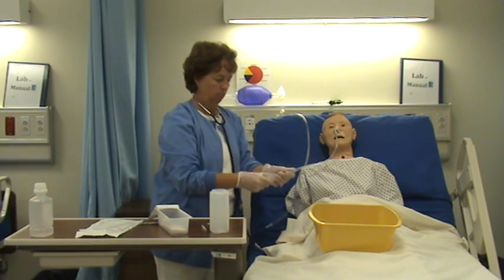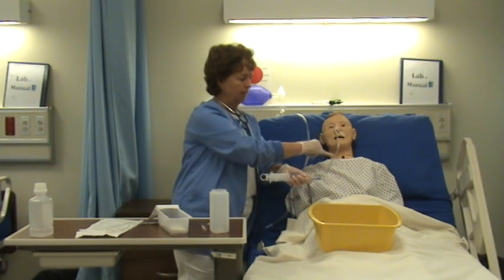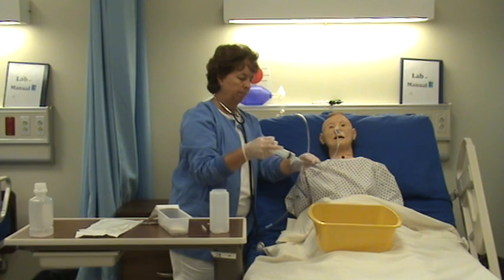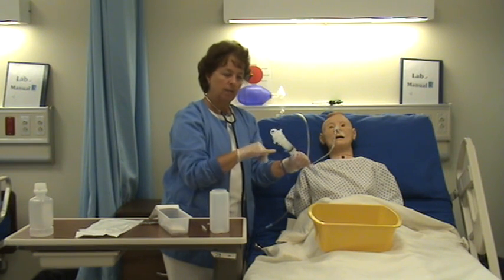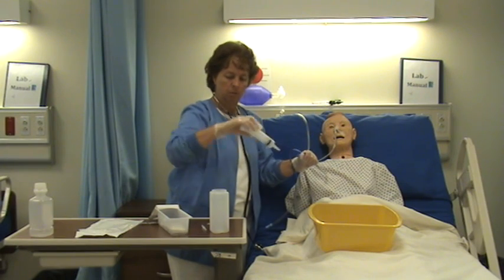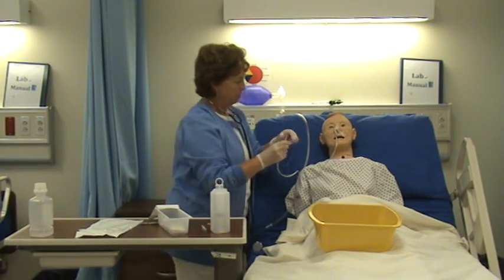The other method, which we're required to do in addition to auscultation, is to aspirate back. I can see some gastric contents coming out, which also indicates the tube is in the proper spot. Some policies may require you to test the aspirate for its pH, but most just require that you visualize it. So I know I'm in the right place.